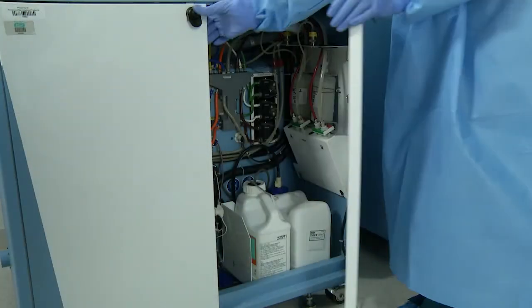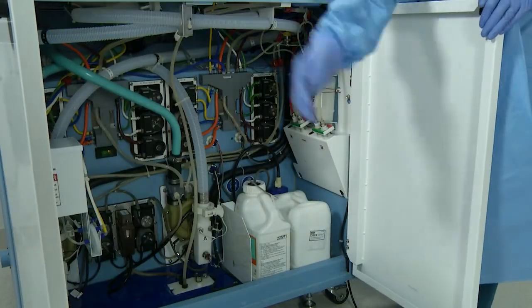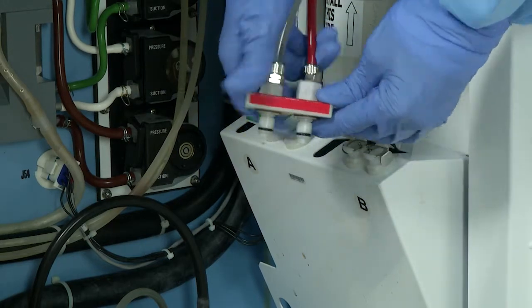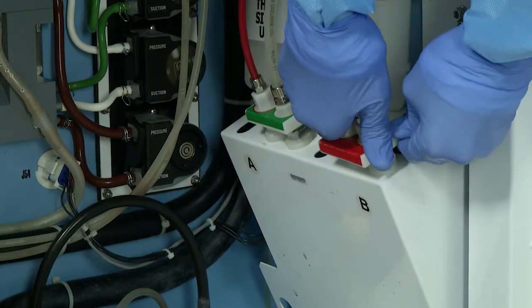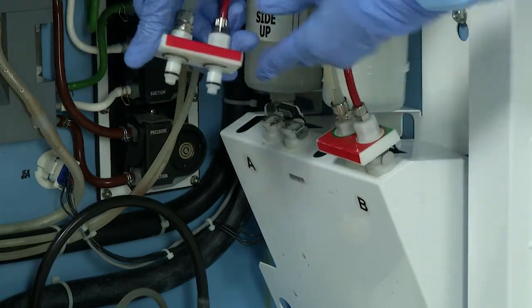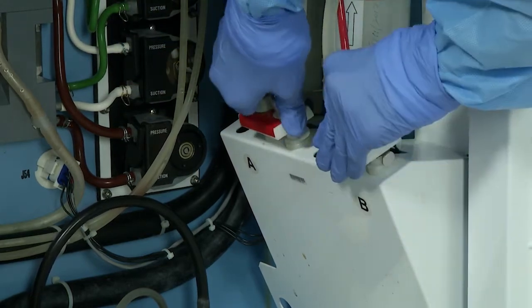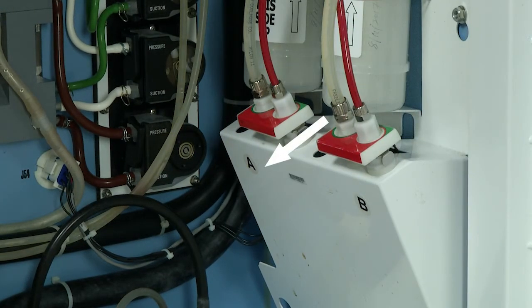Open the right-hand door of the system and unsnap the quick disconnect fitting on the 0.2 micron filter bracket, rotate it 180 degrees, and snap it firmly back into place. You will hear the fitting click into place when properly seated. The red label on the filter connector should be facing left.